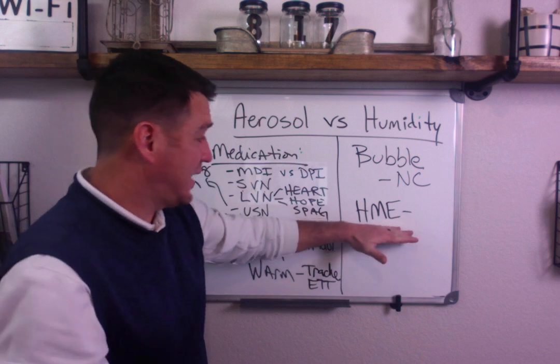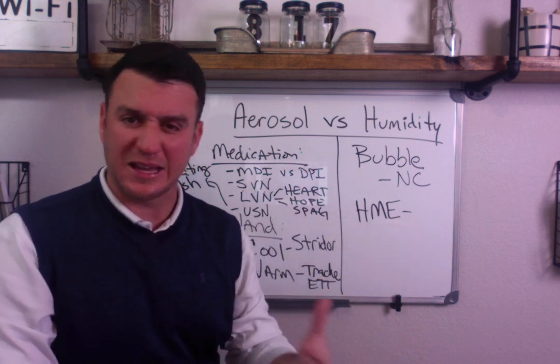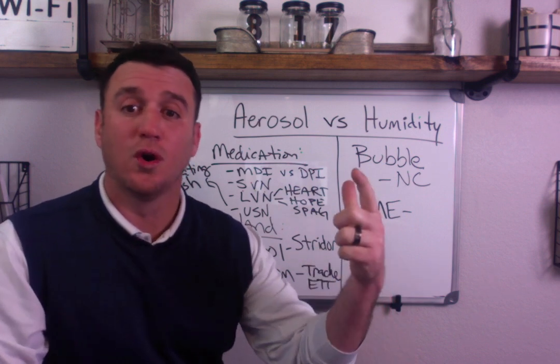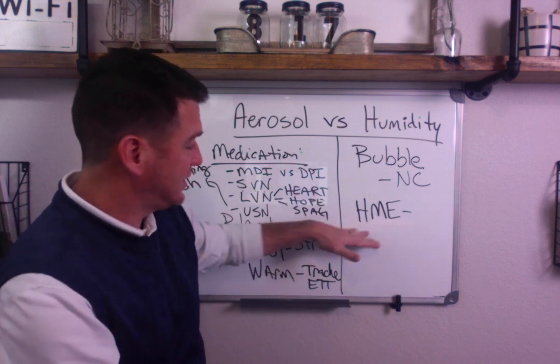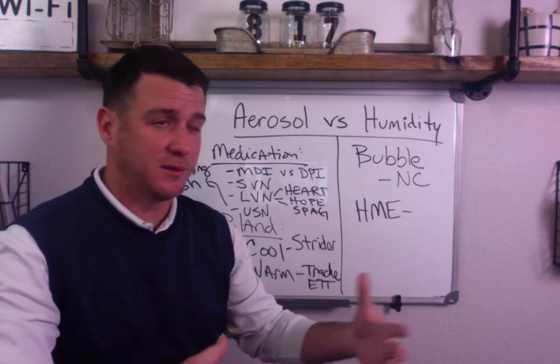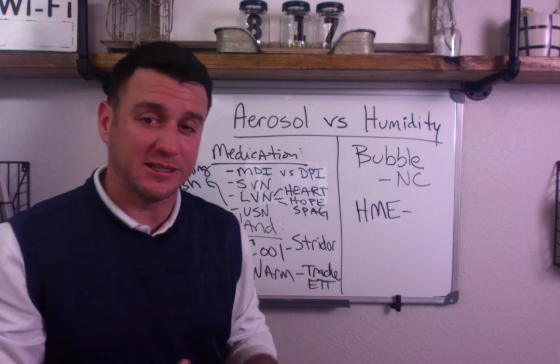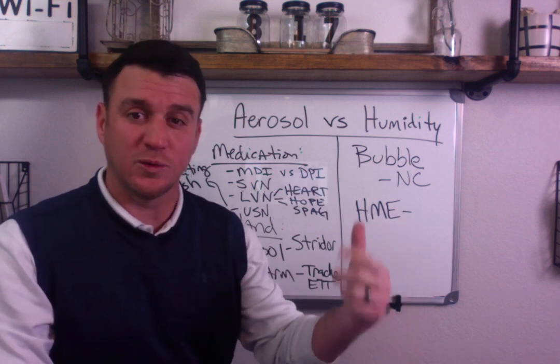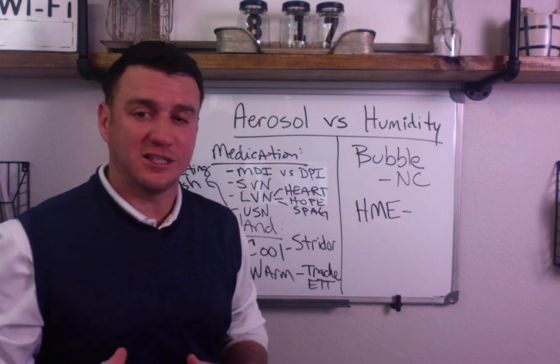Now, when we talk about an HME, we're talking about a patient with a bypassed upper airway. So we're talking about a mechanically ventilated endotracheal tube, nasotracheal tube, or a tracheostomy tube. The research on this is kind of unclear because you kind of see where outcomes are similar to that of a passover. So you've seen a lot of facilities get rid of passovers and just go with disposable circuits, non-heated circuits with an HME.